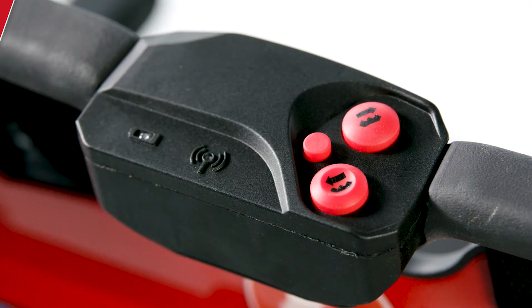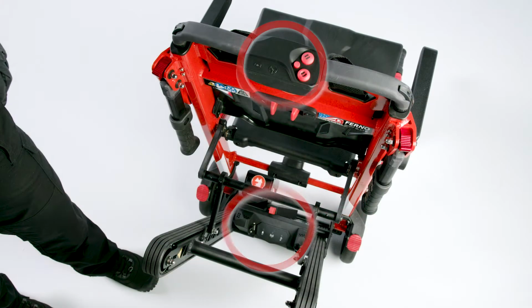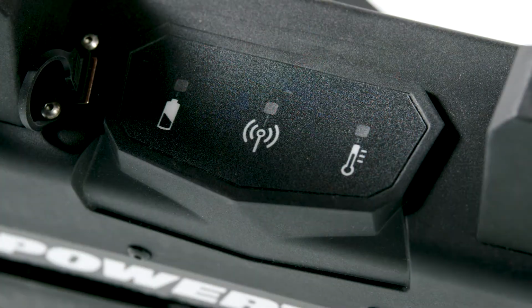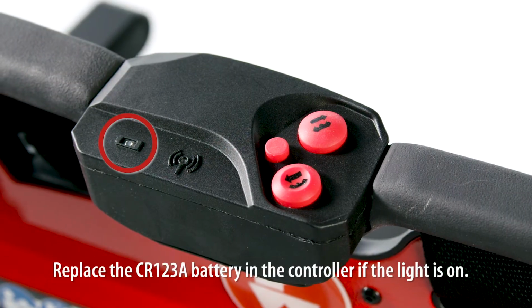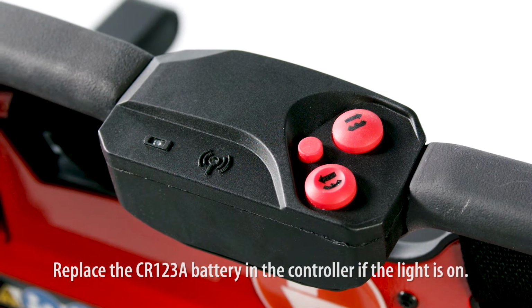The wireless communication light displays the status of the wireless connection between the controller and the power unit. The blue status light will flash once when wireless connection is established. The controller battery light displays the status of the battery in the controller. Replace the battery if the light is on.